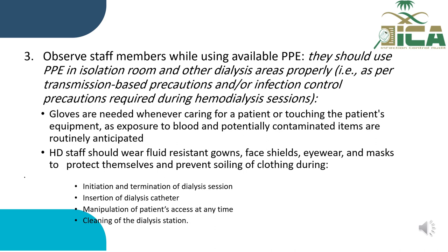Number three, observe staff members while using available PPE. They should use PPE in the isolation room and other dialysis areas properly, as per transmission-based precautions and/or infection control precautions required during hemodialysis sessions.